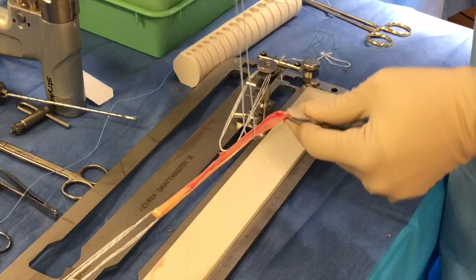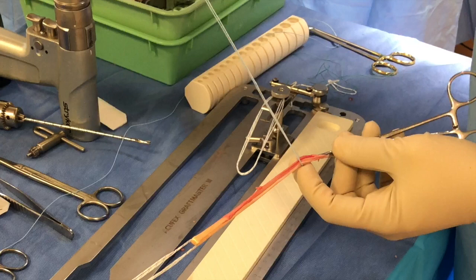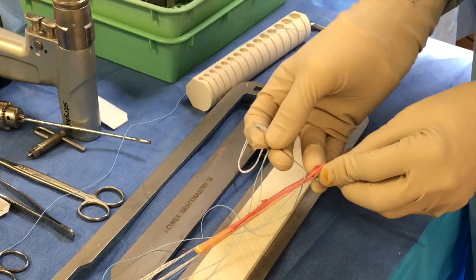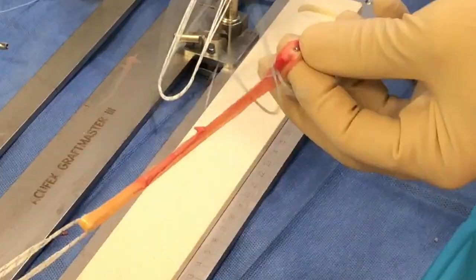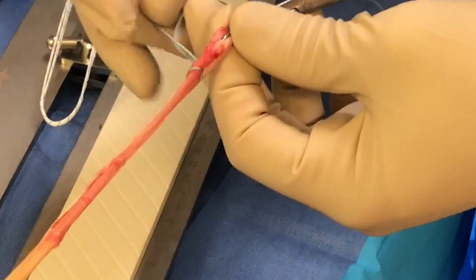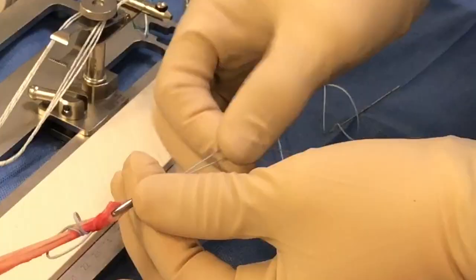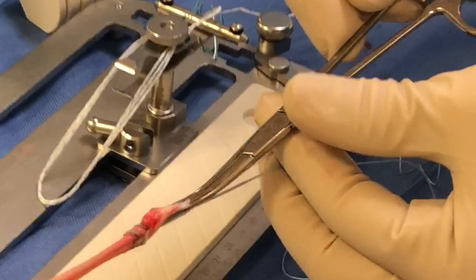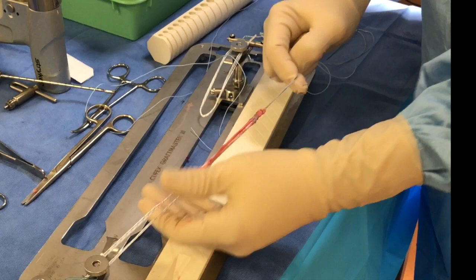You pass the graft over the top and work out where you want the fiber loop to begin. Usually you only need about three passes to get sufficient fixation. You pass the needle through so that you're getting both grafts intact, then pull the graft through until you have the graft locked — doing the same process over three to four times. It just forms a nice round bundle with the grafts locked together.